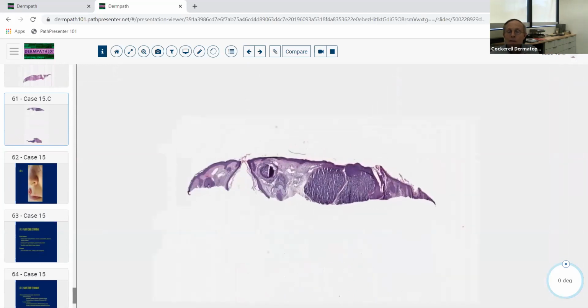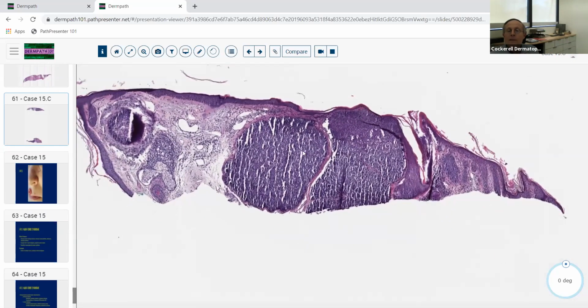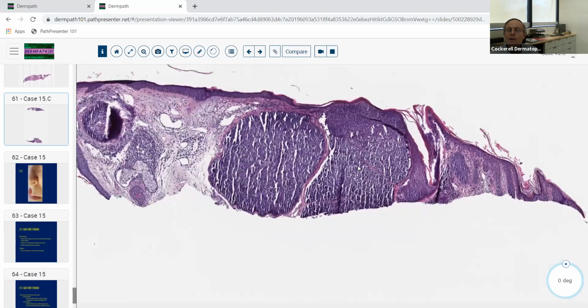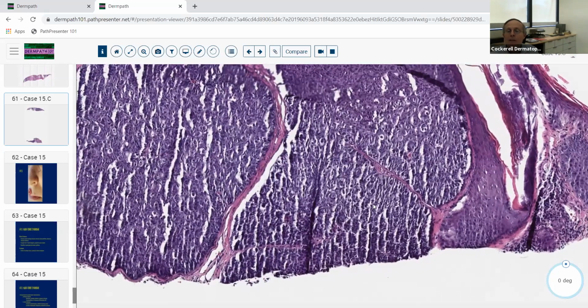Now, which one is this one? So now we've got all of the cells are the inferior little primitive stem cells that are forming this lesion. Notice how small it is still. So this isn't a carcinoma, it's still a papule. This is the sebaceoma. So we have sebaceous adenoma, keratoacanthoma, and a sebaceoma, all from the same patient. So now you don't really need to do microsatellite instability. You know good and well the patient's got to have Muir-Torre syndrome.